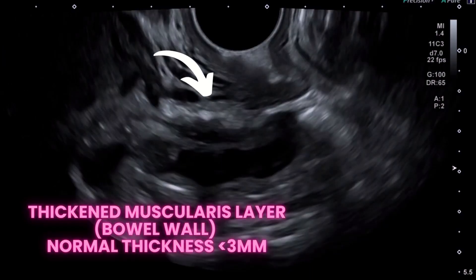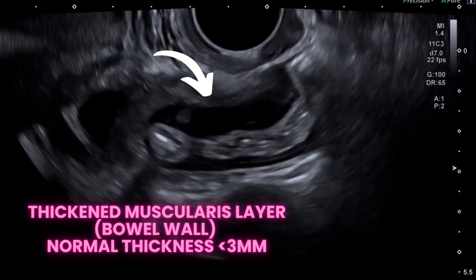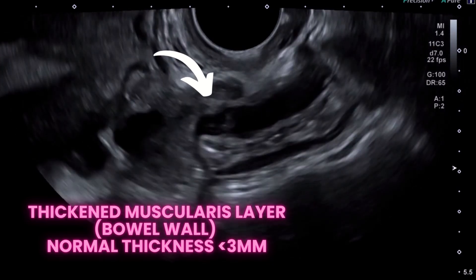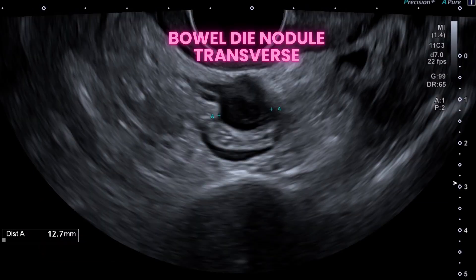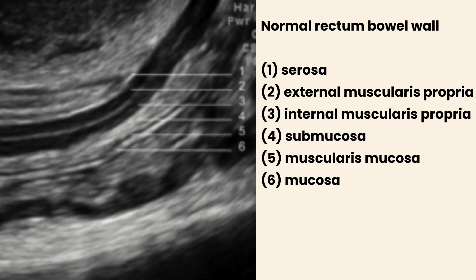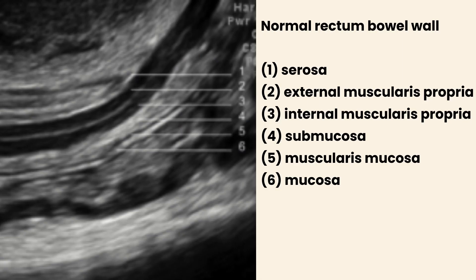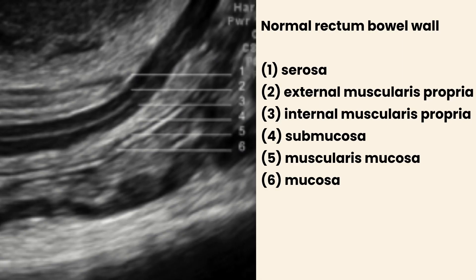Transvaginal scans showed a bowel deep infiltrating endometriotic nodule with a thick muscularis layer. Normal bowel should have a consistently thin and regular muscularis layer of less than 3 mm. This is a transvaginal ultrasound image of the normal rectum bowel layers.